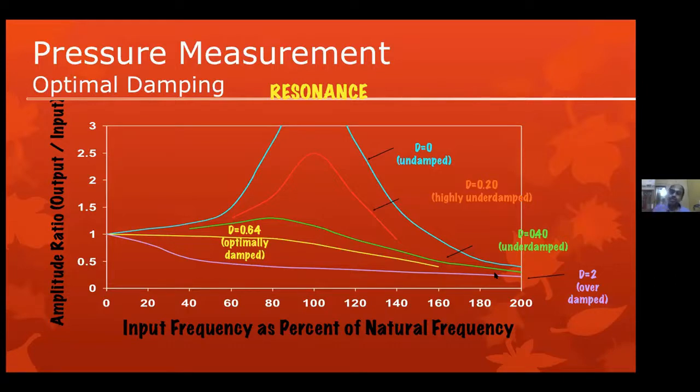Balancing is different. Balancing is adjusting the electrical output of the Wheatstone bridge in order to get an output of 0, and that 0 is equal to 0 millimeters of mercury. Balancing a transducer is done electronically by the machine. Zeroing is done by opening the three-way manually by us.